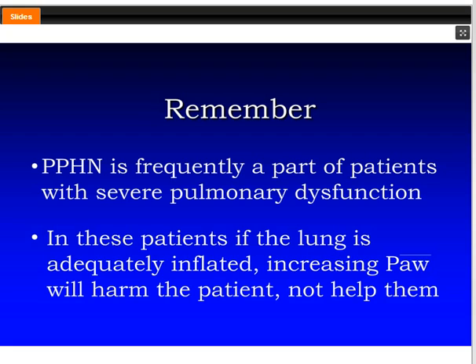You just briefly mentioned tidal volume. How do you gauge tidal volume on high frequency? I gauge it by looking at the chest wall movement. I think for small babies, you want to see a small chest wiggle. And for something like meconium aspiration, you need to see the chest wall bounce better. So that's how I look at it. And then, of course, I use a blood gas to assist me in adjusting and fine-tuning it at that point.